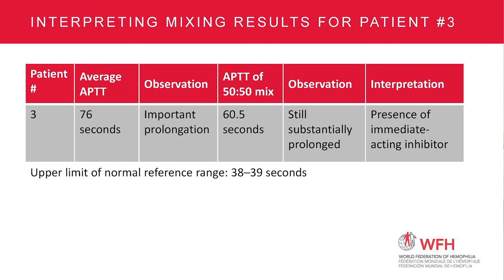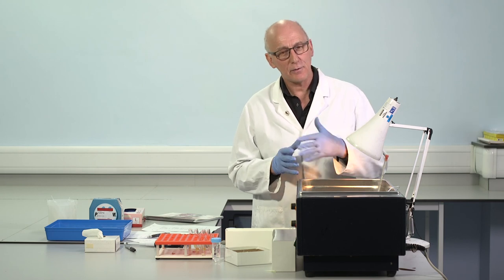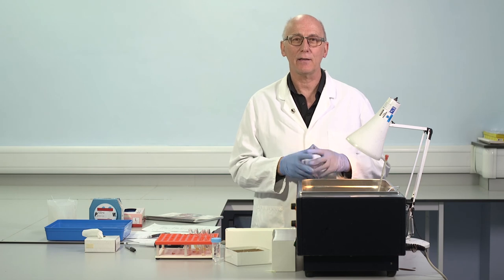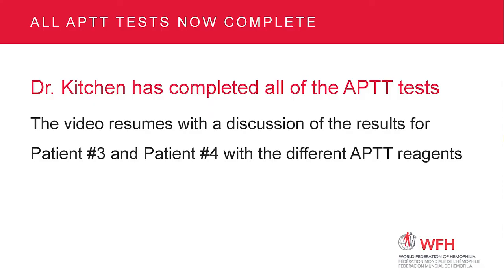We're pretty confident this is an immediate acting inhibitor. Made the mix, did the test, still grossly prolonged. A little bit shorter, but some dilution. So consistent with lupus anticoagulant, certainly an immediate acting inhibitor. Now finishing the APTTs with the secondary agent. For number three, 35 seconds.